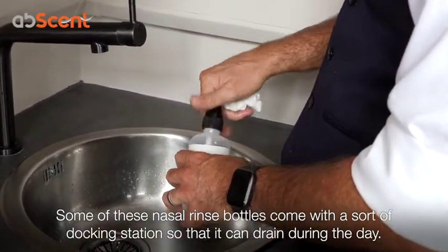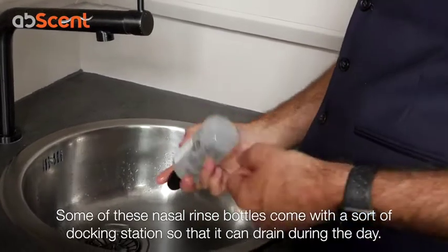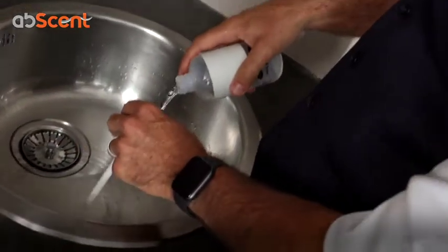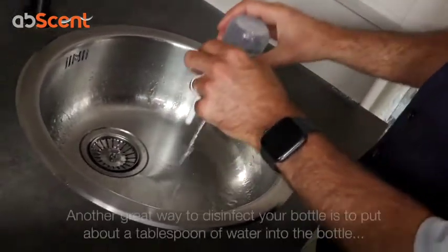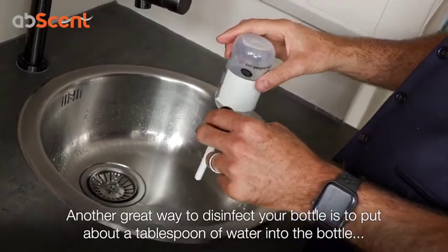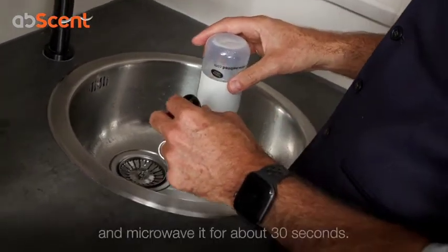Turn it upside down. Some of these nasal rinse bottles come with a kind of docking station, so you can tip them upside down in between uses so that they drain out properly. Another great way to disinfect your nasal rinse bottle is to put about a tablespoon of water inside and stick it in the microwave.